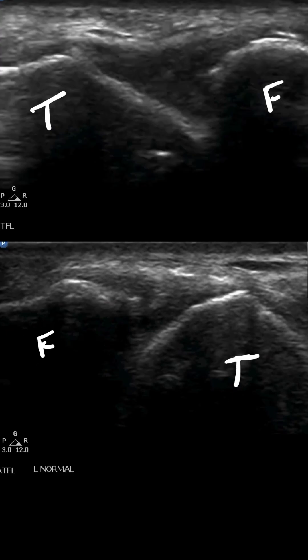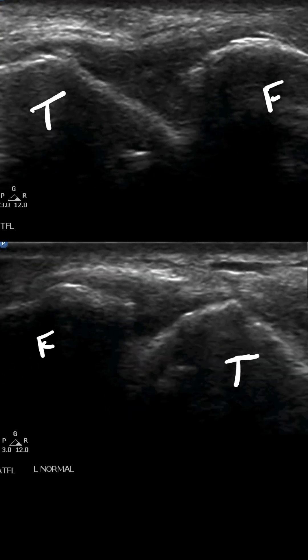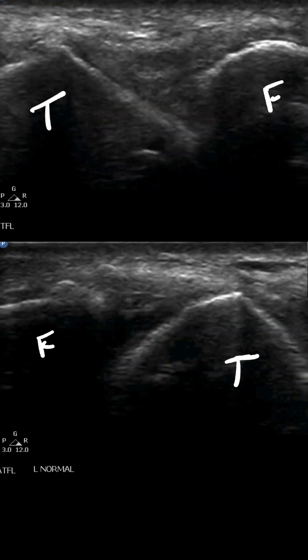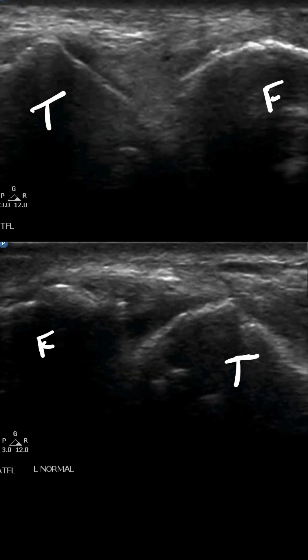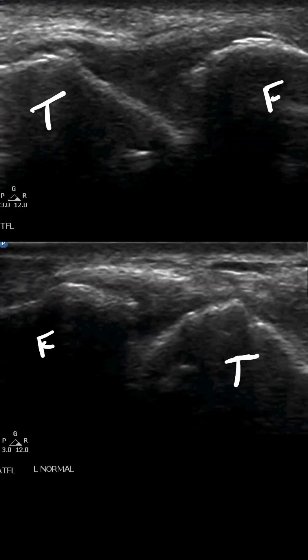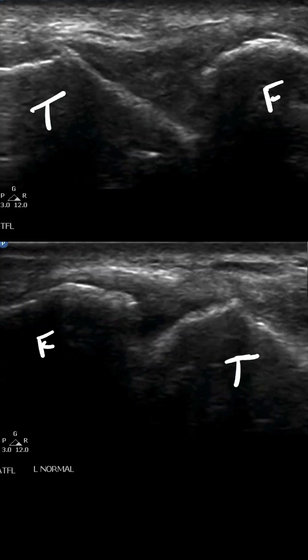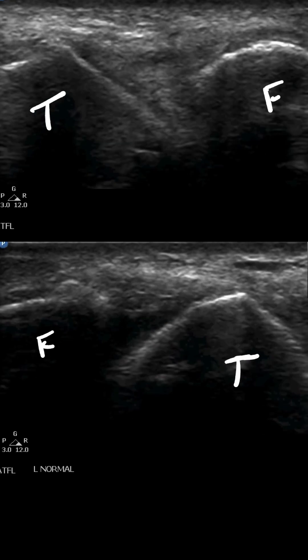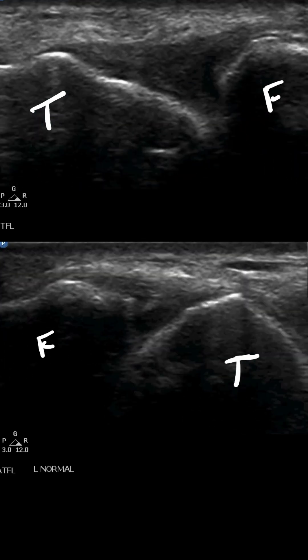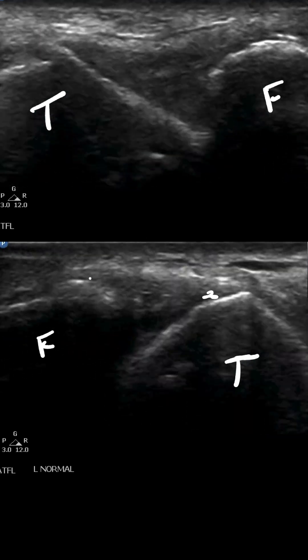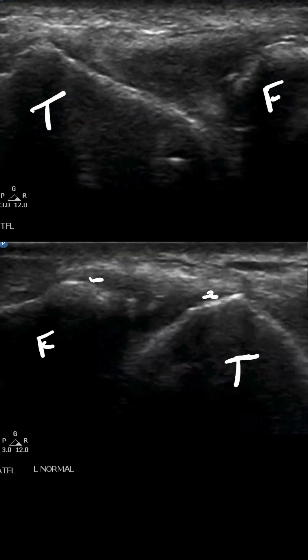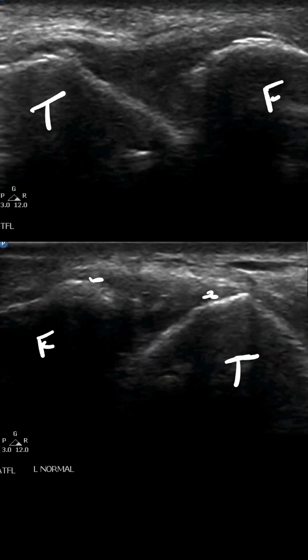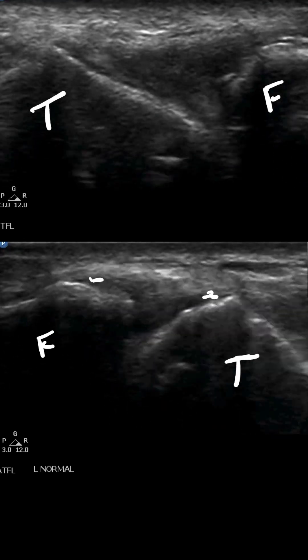As stress is placed on that ATFL ligament in the upper image, we see the joint space widen. When the same stress is placed on the left side, we can see a lack of widening of that space. You can even see a little bit of the architecture of the ligament between these two points. This clip shows findings consistent with an ATFL tear on the right side.